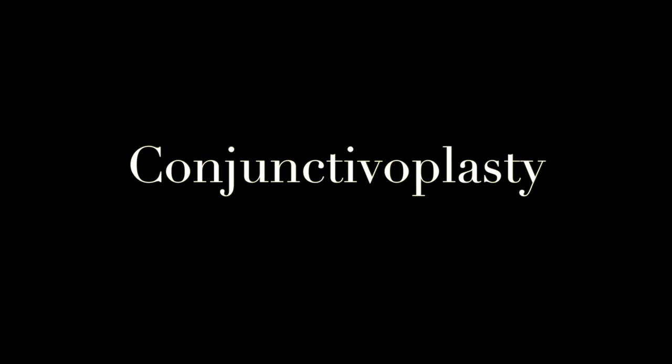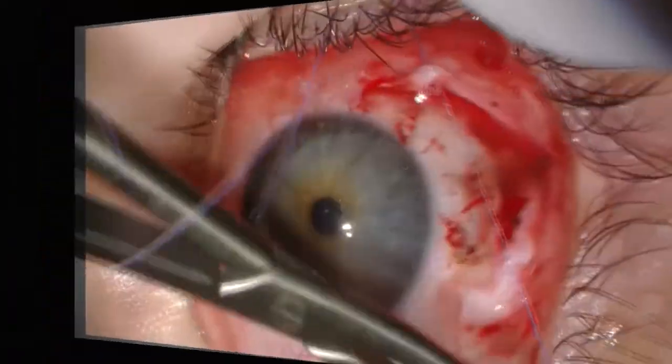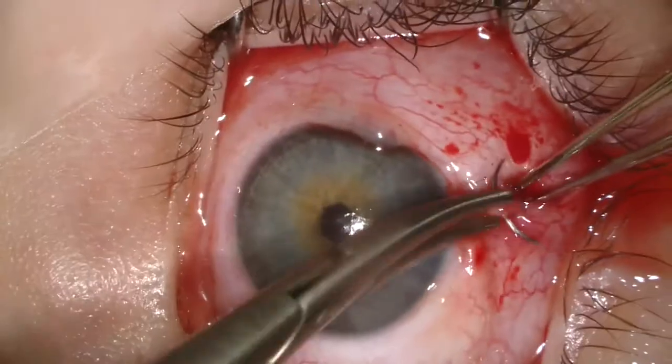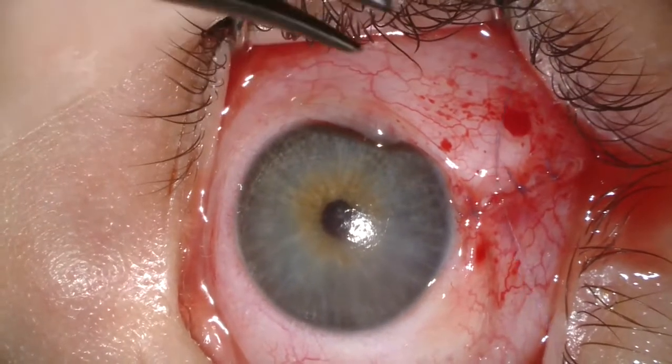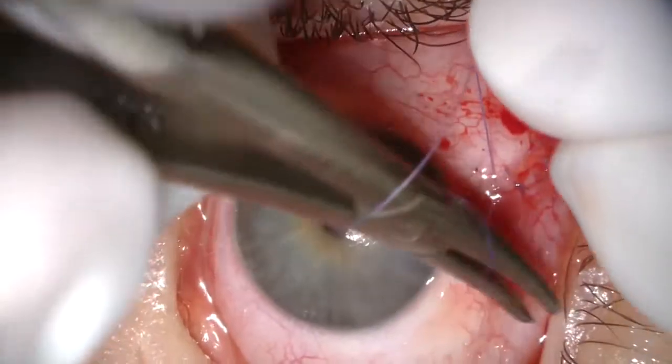We're doing double layer closure with Tenon's fascia first. Often we'll place two or three of these Tenon's fascia sutures to recreate the natural appearance of the conjunctiva at the limbus. Then we place our epithelial sutures to cosmetically recreate the ocular surface.